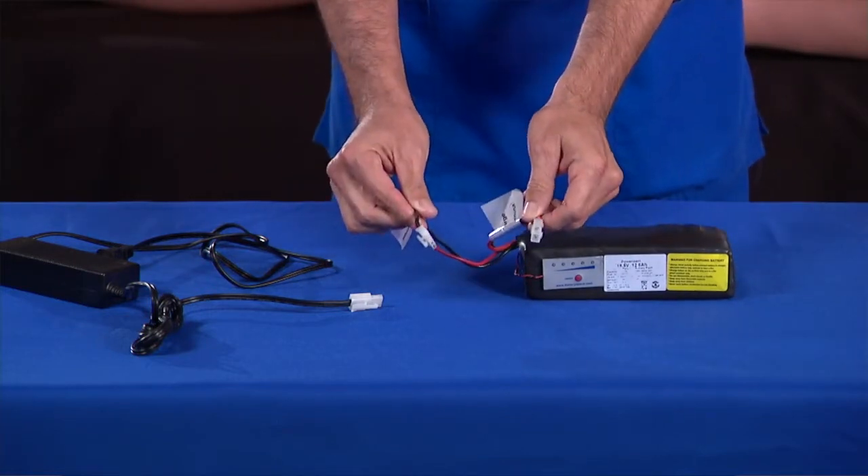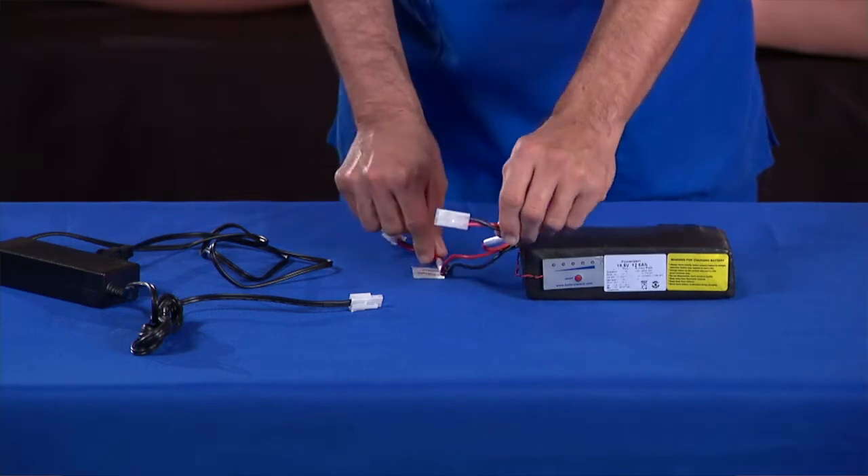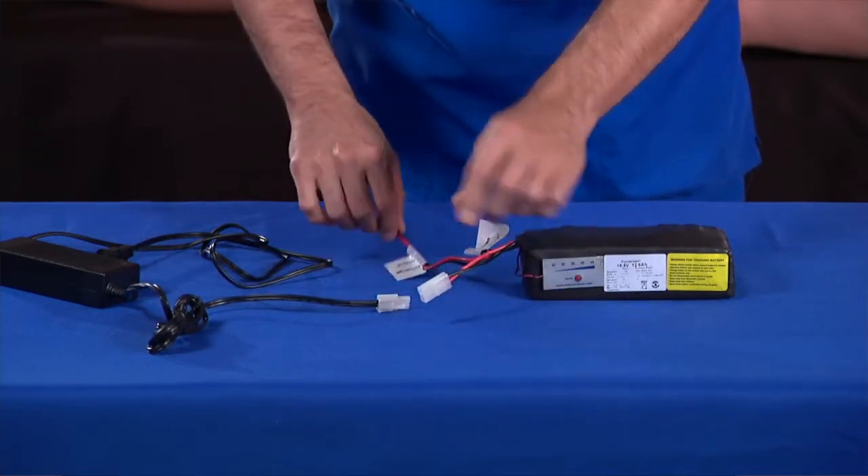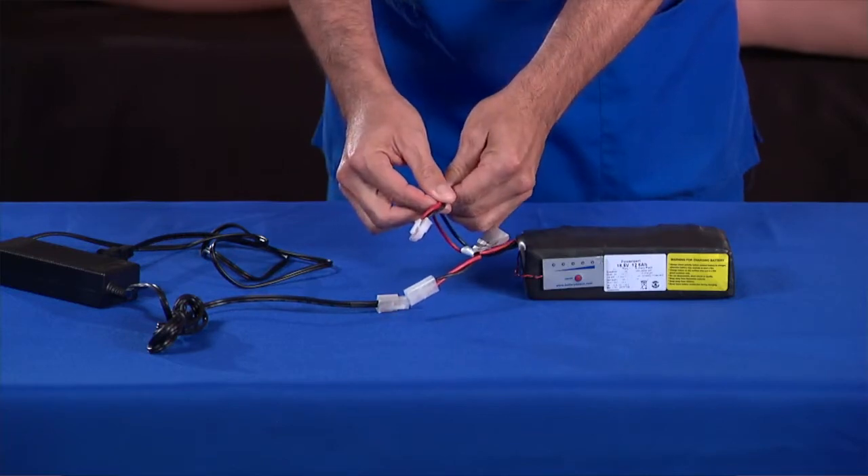On one end of the battery, there are two leads. Each one has a different connector. The female connector connects the battery to the battery charger. The male connector connects the battery to the simulator.